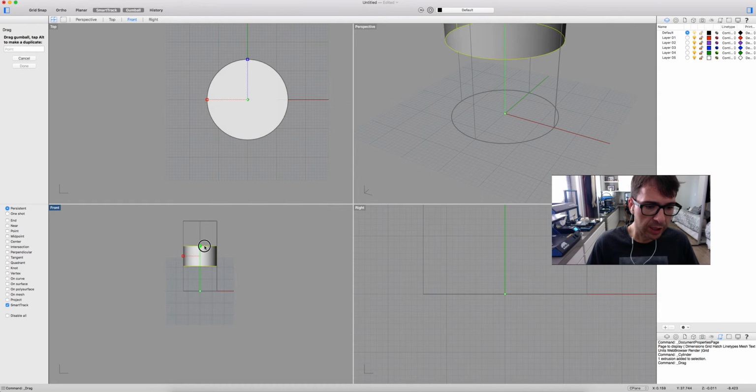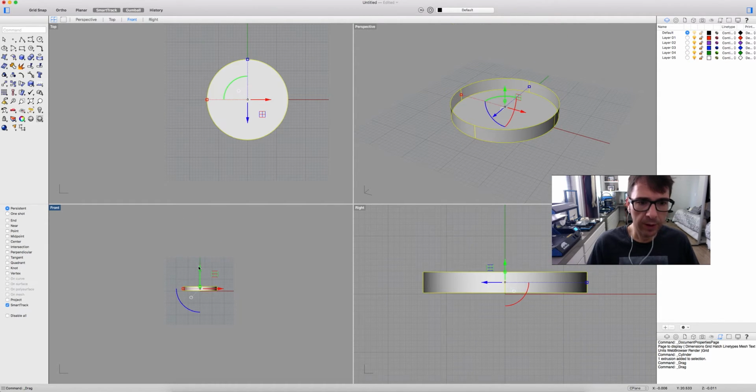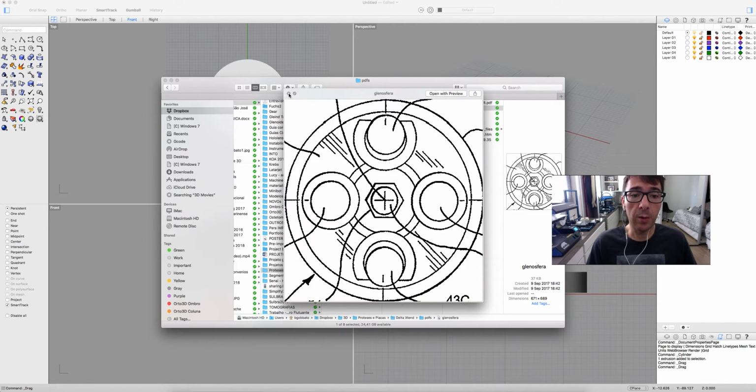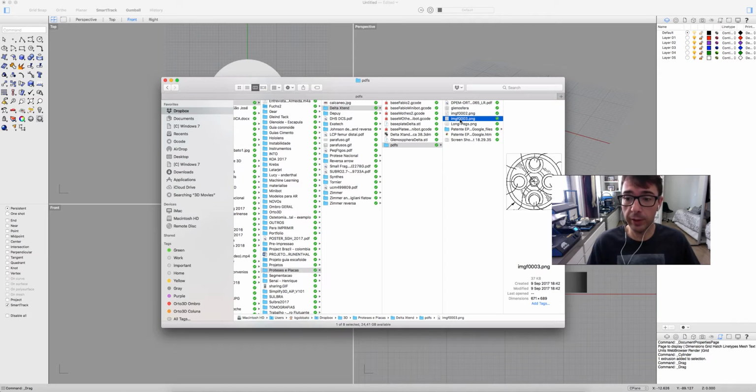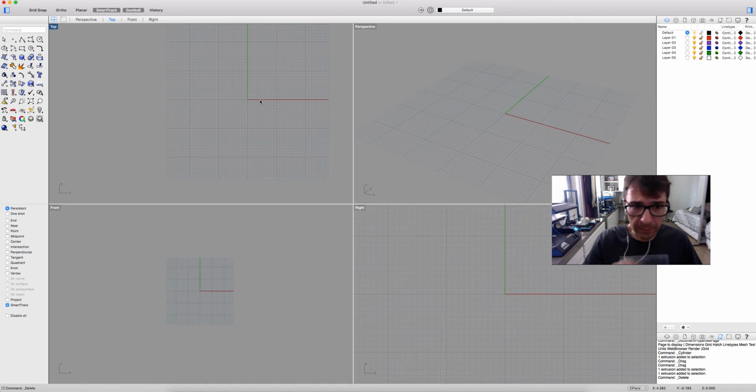Let's change the offset to the correct offset, as we measured in our PDF. So now we have the central part here. This corresponds to the base plate. I'm going to go back, and I'm going to show a different way to do that.